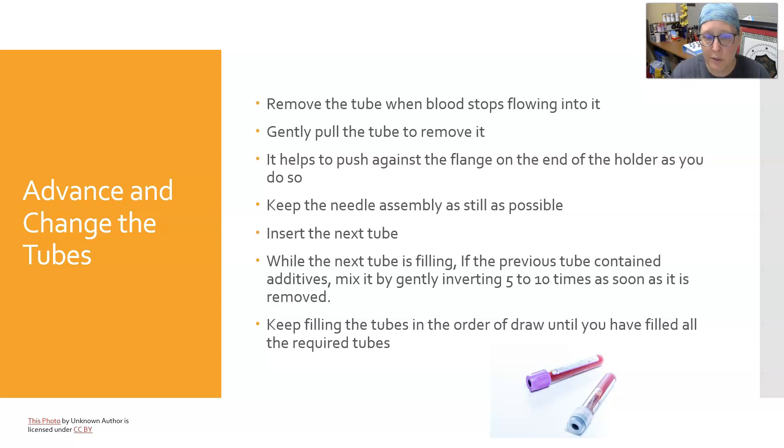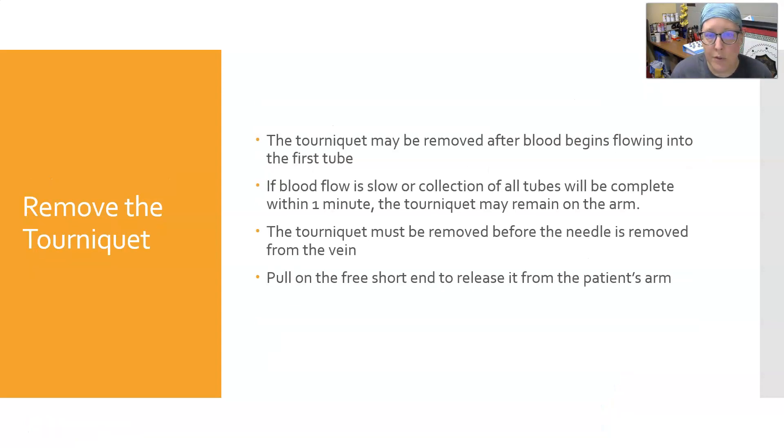While the next tube is filling, if the previous tube contained an additive, mix it gently by inverting it five to ten times as soon as it is removed. Keep filling tubes in order of draw until you have filled all required tubes. The tourniquet can be removed after blood begins flowing into the first tube. If blood flow is slow or collection will be complete within a minute, the tourniquet can remain. The tourniquet must be removed before the needle is removed from the vein or blood will squirt everywhere. Pull on the free short end to release it — popping the tourniquet.